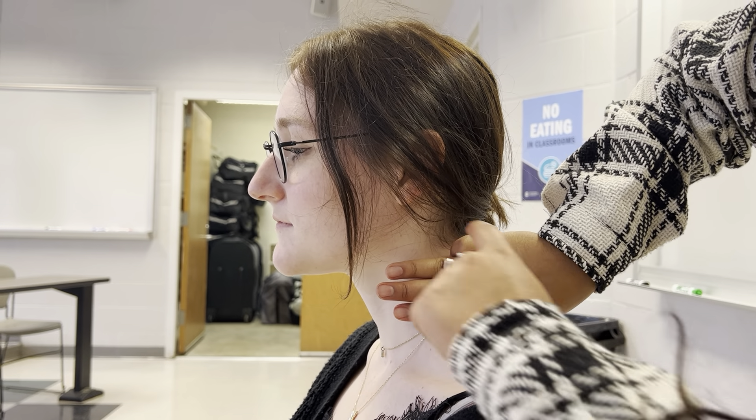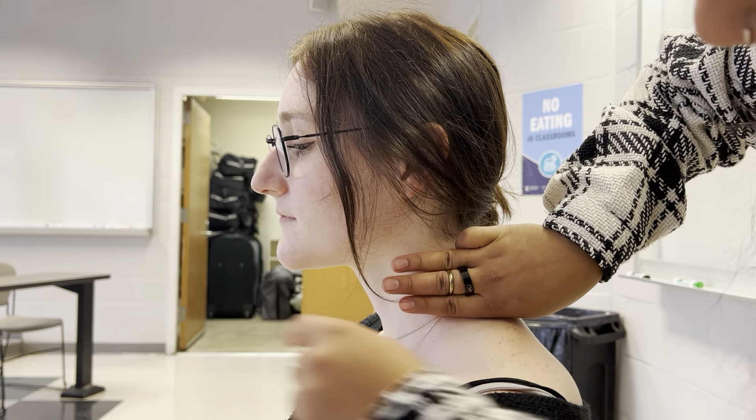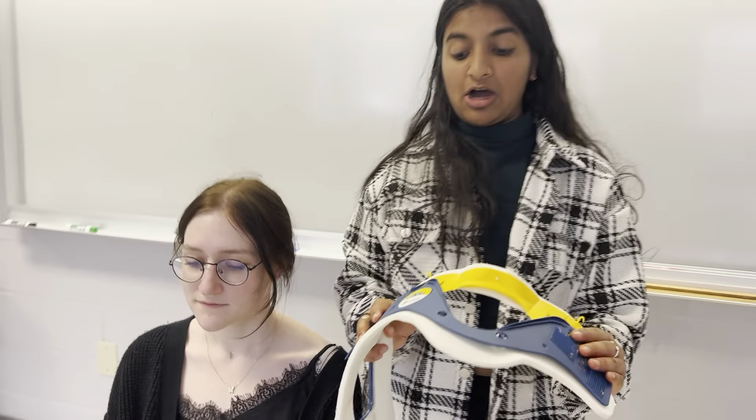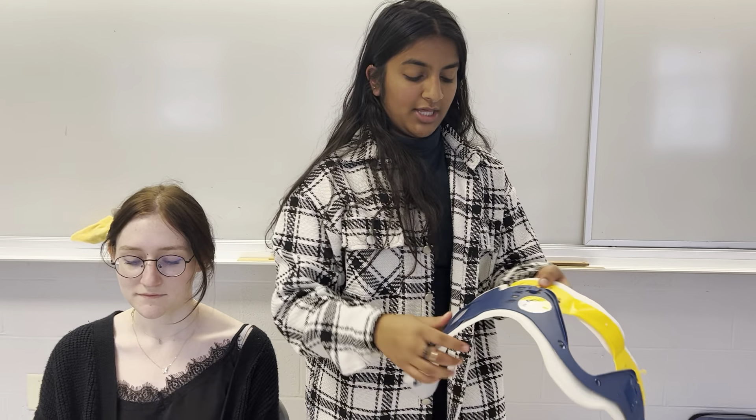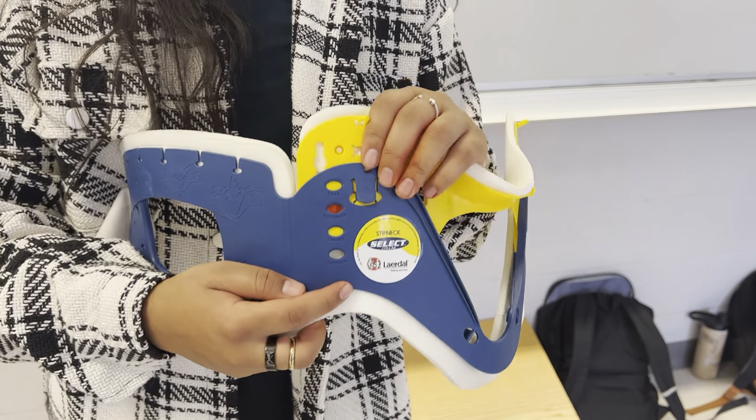For the patient, you need to look and figure out that measurement from the top of the shoulder to the bottom of the chin. Then I'm going to take my C-collar and on this blue part right here — that is the only part that I'm going to measure on.